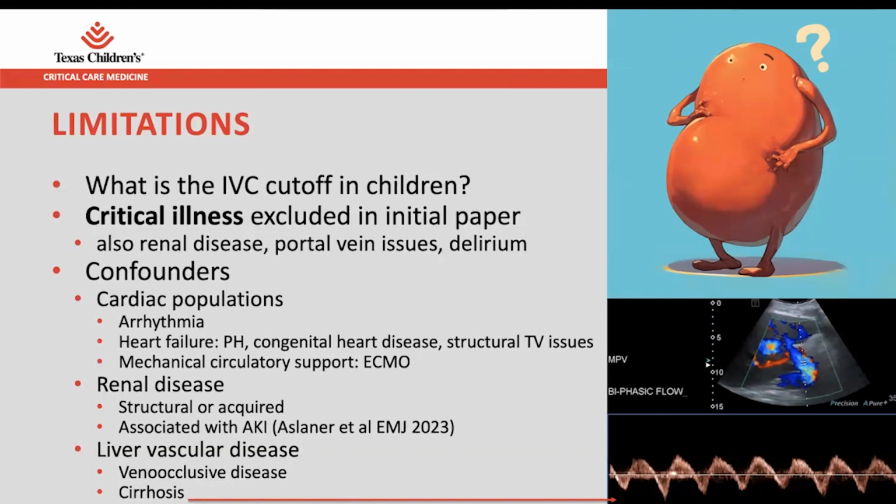The papers are not out there right now, so we'll get to it later. But the one paper that's out there right now uses IVC standards that were published by Kathiria et al. And it just leaves open the question as to whether or not Z-scores and age-based standards or aorta might be ways to try to classify these patients.